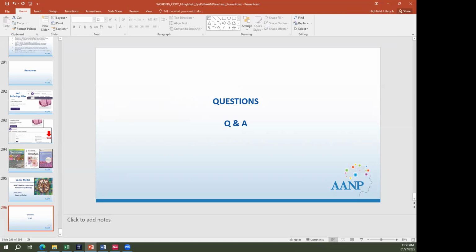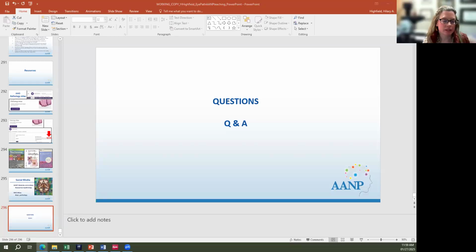Besides AR, do you recommend any other IHC for sebaceous cancer? That's the one that I use. So, everybody wants to do an oil red O, but you have to do that at the time of frozen section, right? So there's nothing else that I really recommend for that.